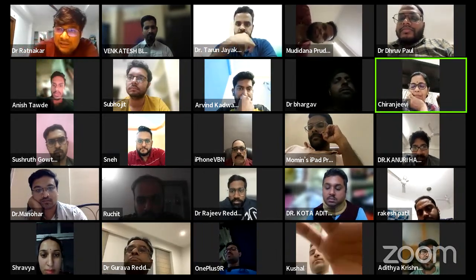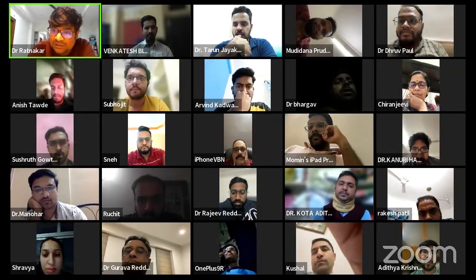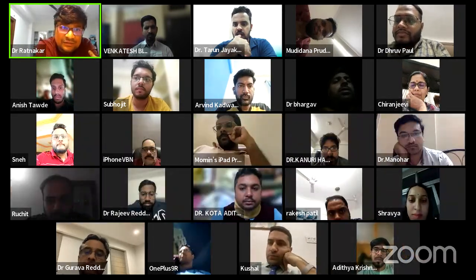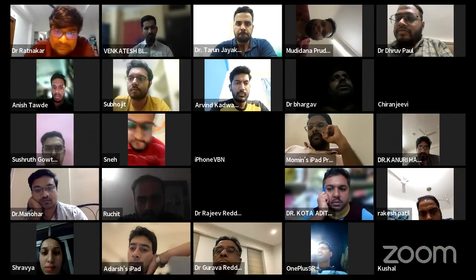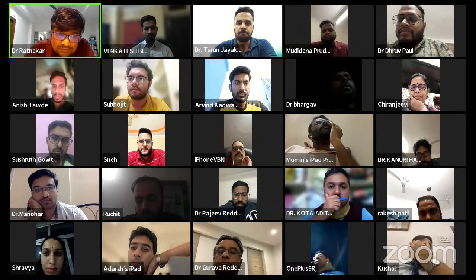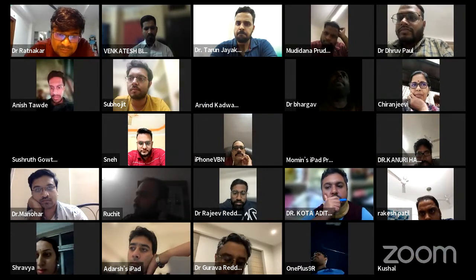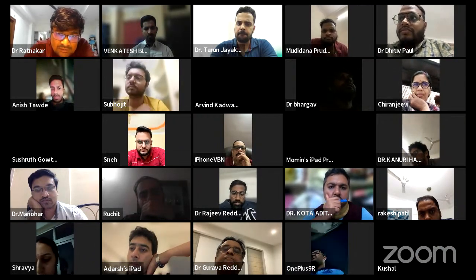Sir, what all changes in upsizing and downsizing the femoral component with respect to the implant? Gaurav, can you just clearly ask your question? Unmute yourself. Good evening, sir. Yes, Gaurav. Sir, what changes does the upsizing and downsizing do to the component? I mean, the distal thickness increases and the posterior thickness increases.